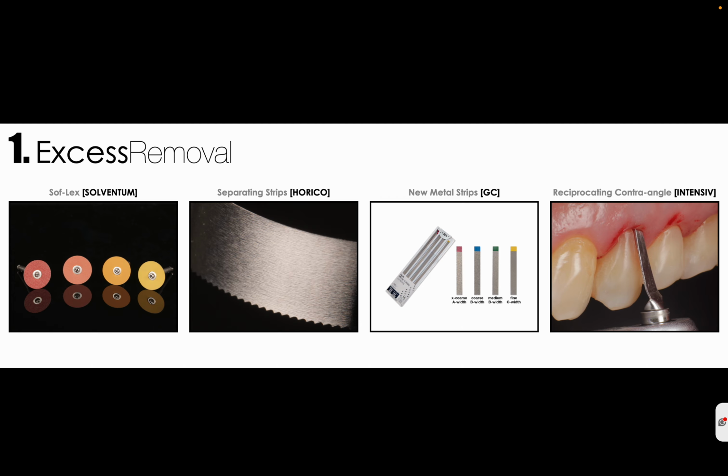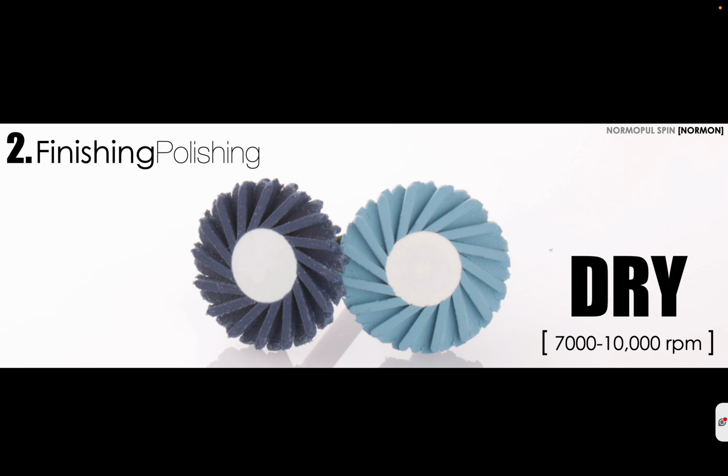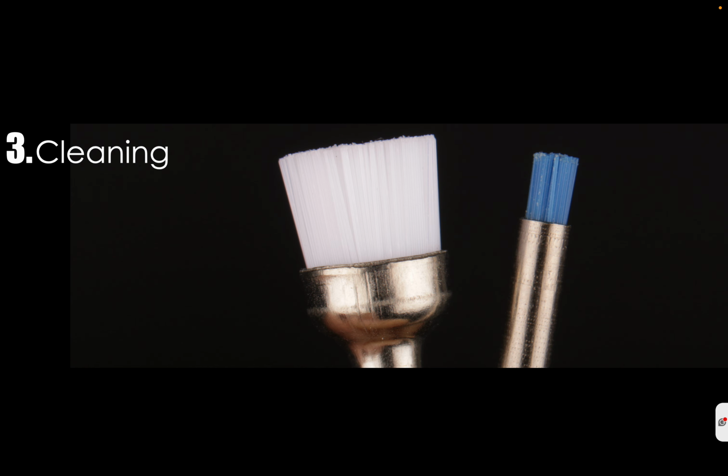But after all, when you have the contact points good and everything, you can go to the gingival aspect just to polish and obtain a good polishing of this part. Also, you can choose a polishing system that is easy to apply. For me, I normally use this one from Normon also. These two caps, one is for polishing, one is for finishing. And it's really convenient, because with two caps you obtain a good glossy surface and you don't need anything more.